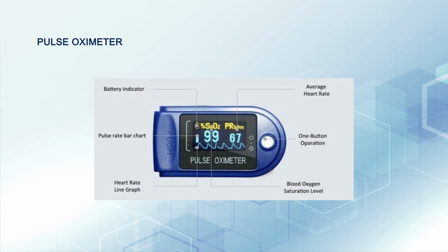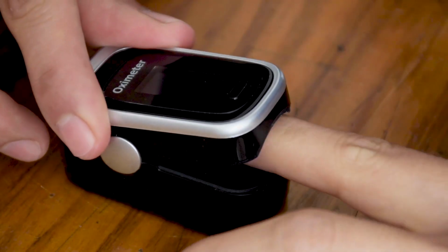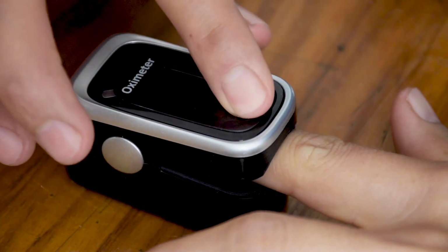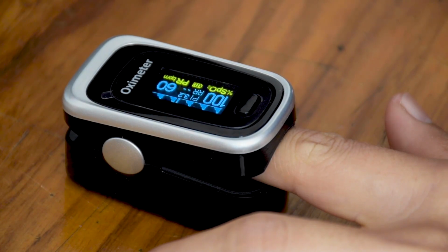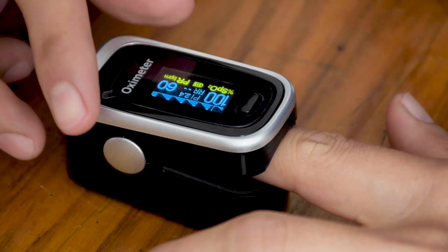Next, a pulse oximeter. A pulse oximeter is a medical device used to measure two vital parameters, oxygen saturation level and pulse rate. It is a non-invasive and portable device commonly used in healthcare settings, home care and during physical activities. The pulse oximeter provides valuable information about the oxygen carrying capacity of a person's blood and their heart rate, making it a crucial tool in monitoring respiratory and cardiovascular health.